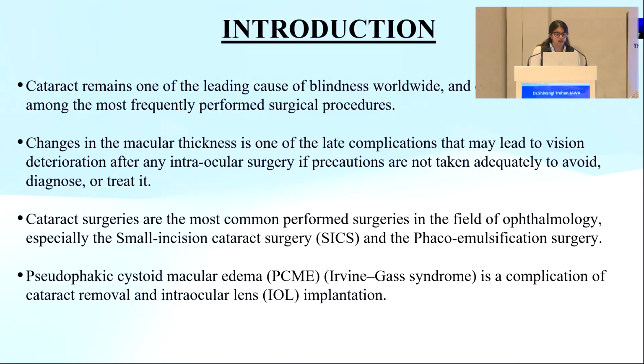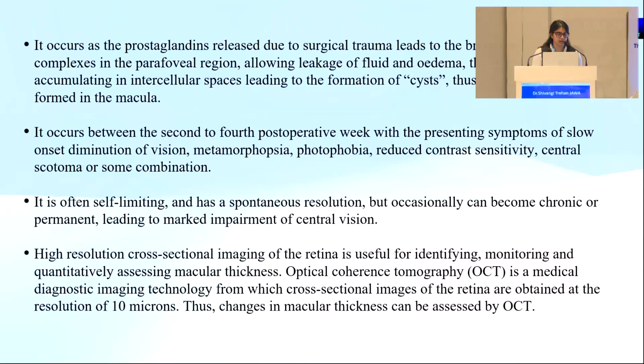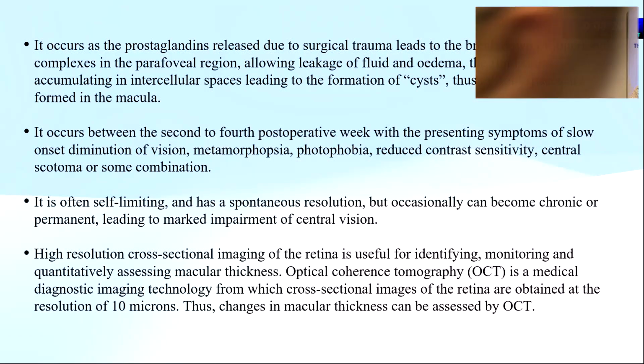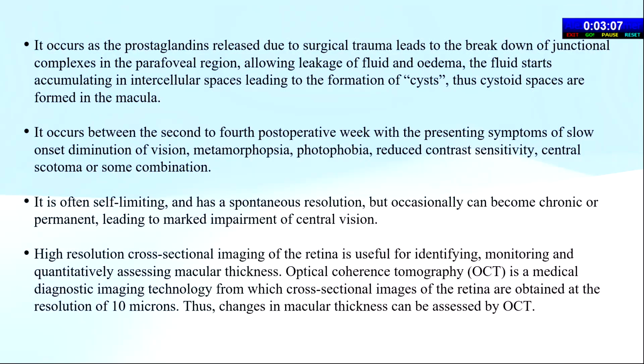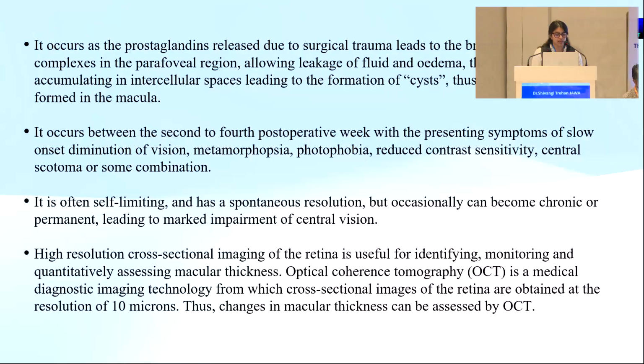Pseudophakic CME, known as Irvine-Gass syndrome, is a complication of cataract removal and IOL implantation. It occurs as the prostaglandins released due to surgical trauma lead to the breakdown of the junctional complexes in the parafoveal region, and fluid starts accumulating in the intercellular spaces, leading to the formation of cysts. It is often self-limiting. In our study, we used OCT, a medical diagnostic imaging technology from which cross-sectional images of the retina are obtained at a resolution of 10 microns, to measure the central macular thickness.